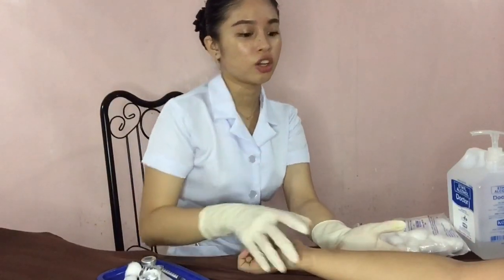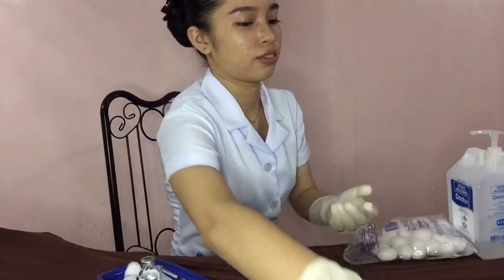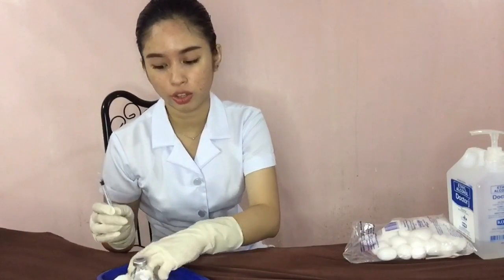Now assist the patient into a comfortable sitting position. Now ma'am, it is all done. Don't forget not to recap or reuse the needle. Discard the needle and the syringe in the appropriate receptacle. Then wash your hands and document the procedure.